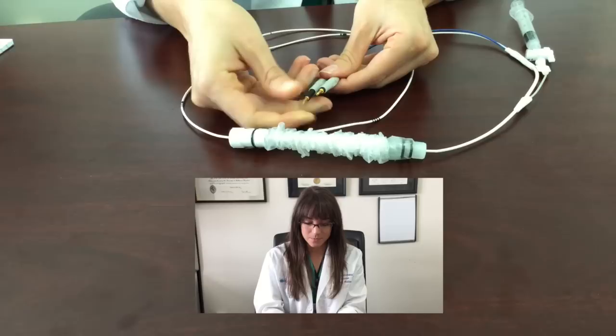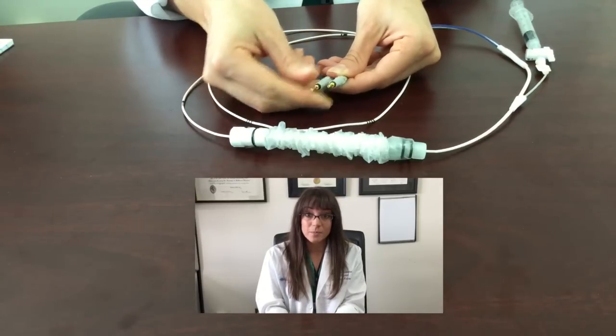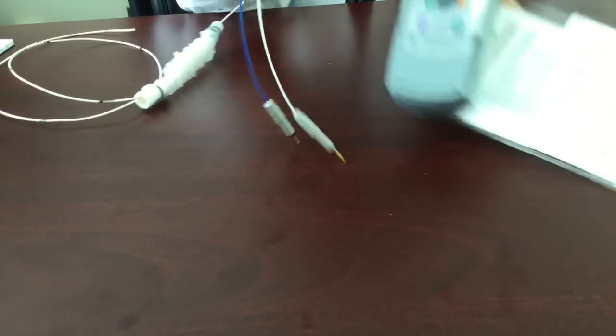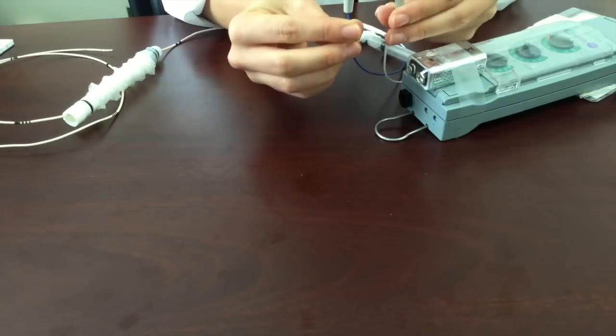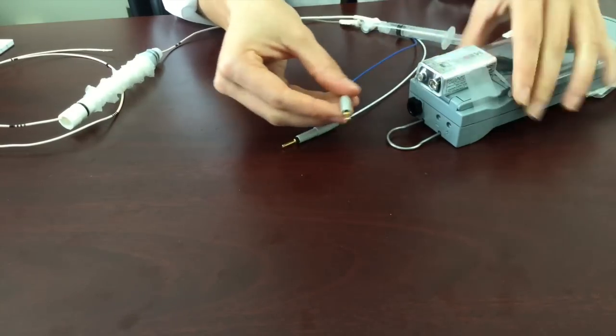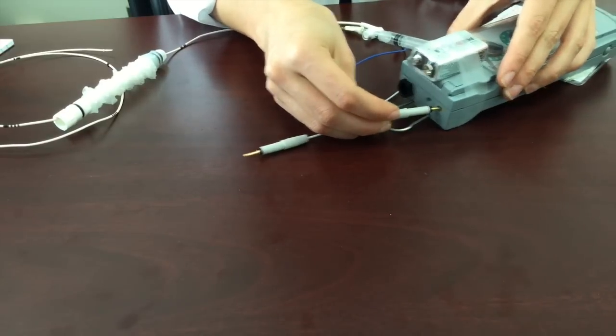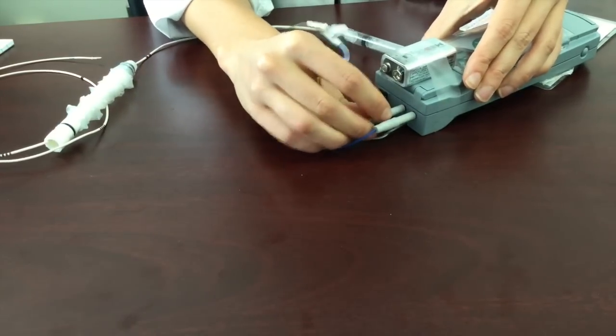You actually have to push pretty tight until almost all the black is in the grey. Now, I am acting as my own non-sterile assistant. We take these pins and we are going to take the positive end shown here and place it into the positive end of the box. Then you take the minus end here and place it into the minus end of the box.